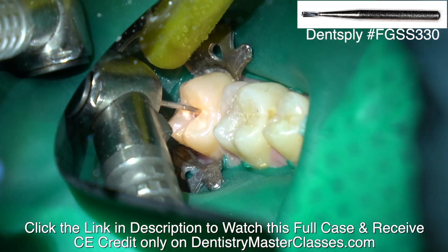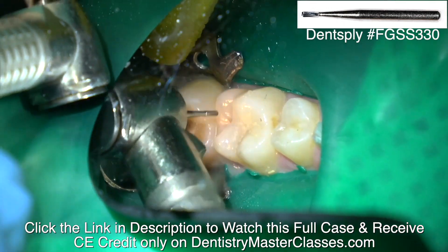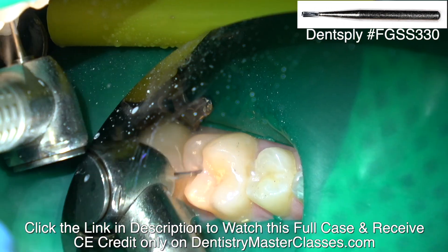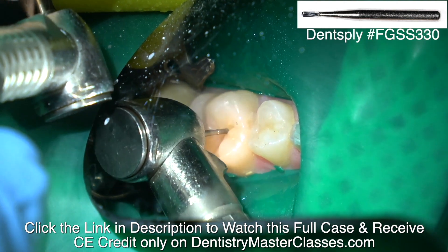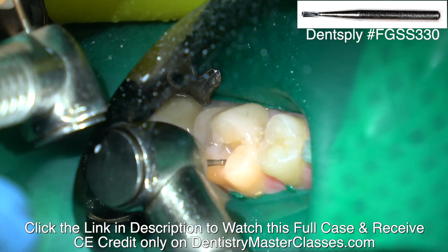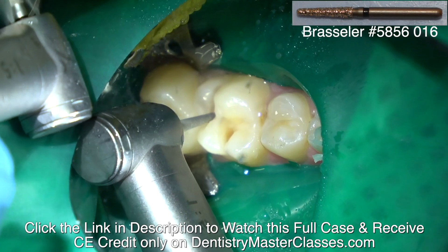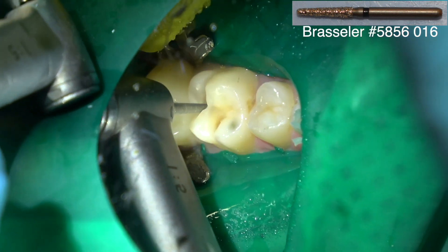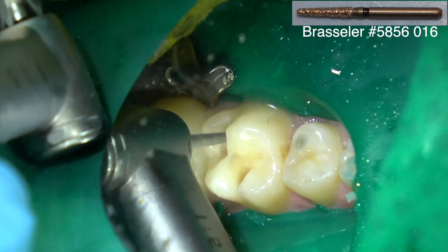I'm placing composites on these teeth where I'm replacing the sealant with decay underneath it. Using a 330 carbide burr, isolated with a rubber dam — makes the assistant's job so much easier. One of the first things you want to do when placing a sealant is be sure there's not decay down in that groove. That's another thing the mosquito diamond does — it opens it up a bit so you've got a better view of the underlying groove, and if there's decay then you ought to place a composite filling. You want to remove that decay; you don't want to place the sealant on top of decay.